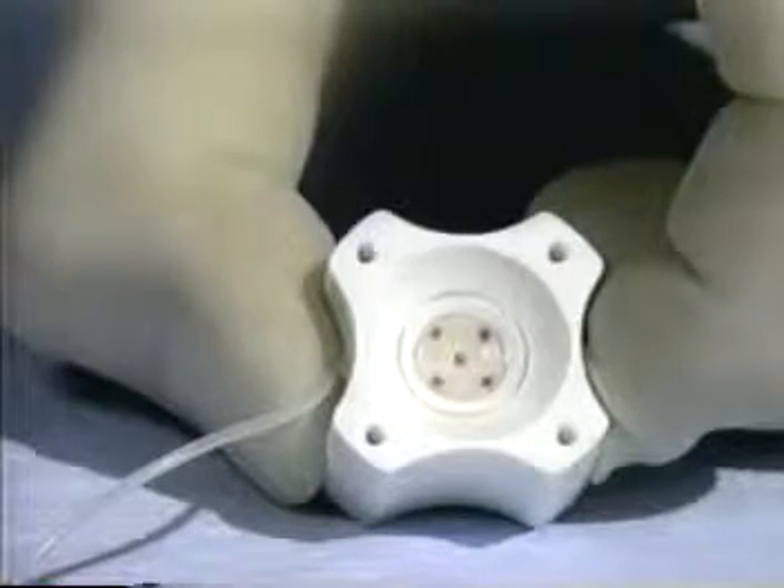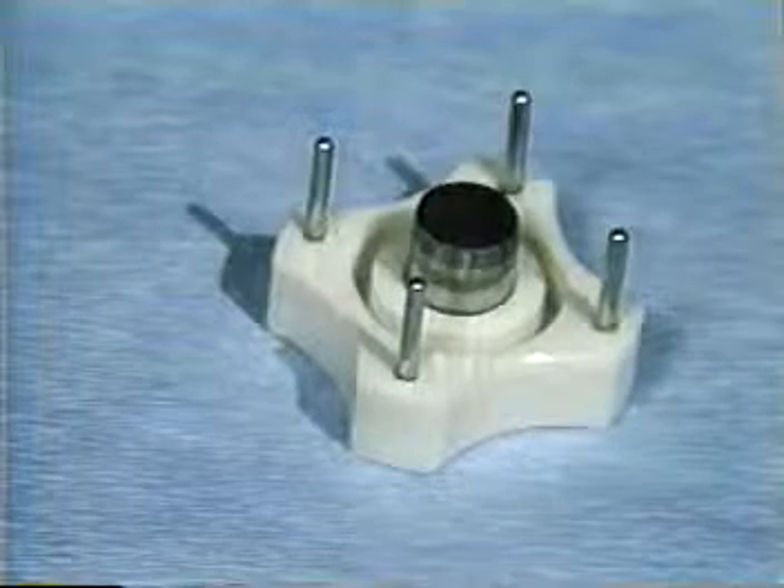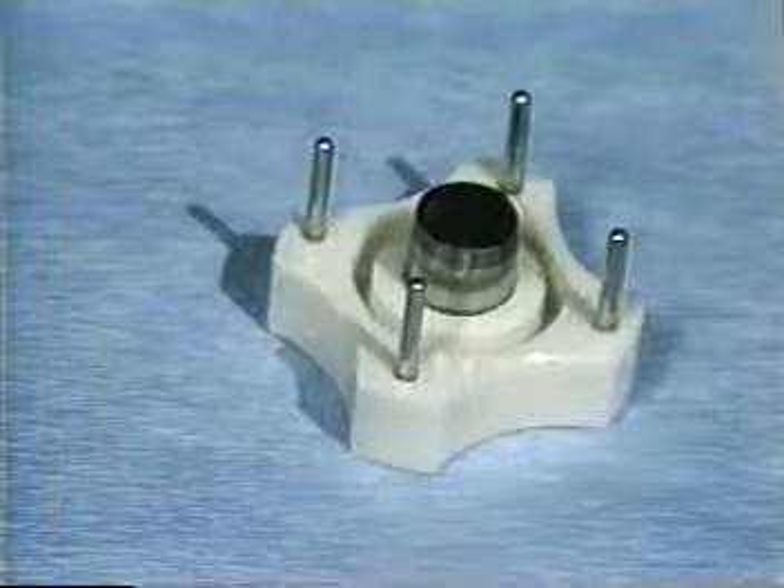The Barron vacuum donor cornea punch is available in diameters of six millimeters, six and a half to nine millimeters in quarter millimeter increments, and nine and a half millimeters.